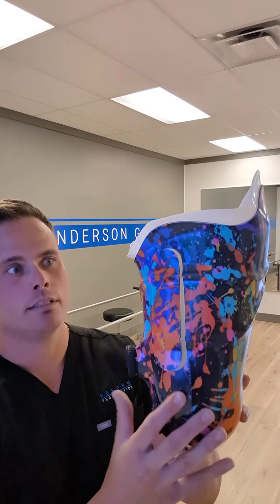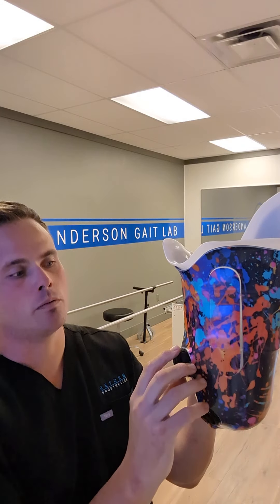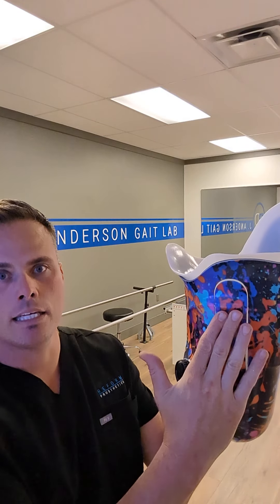So what we have here is the anterior part of the socket. This little panel, when he tightens up the socket, will compress into the scarpus triangle and make this area inside compress and tighten up. That'll push him back into the ischiotuberosity, which is good biomechanically.